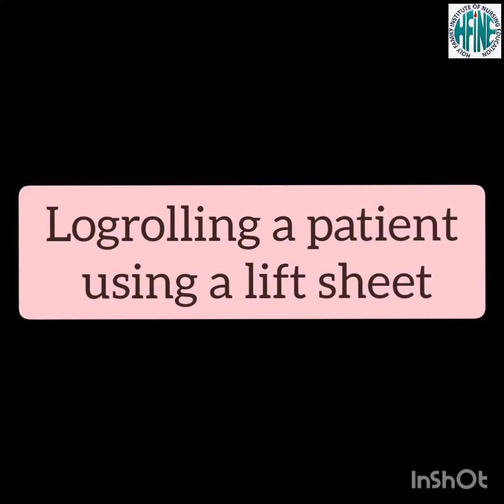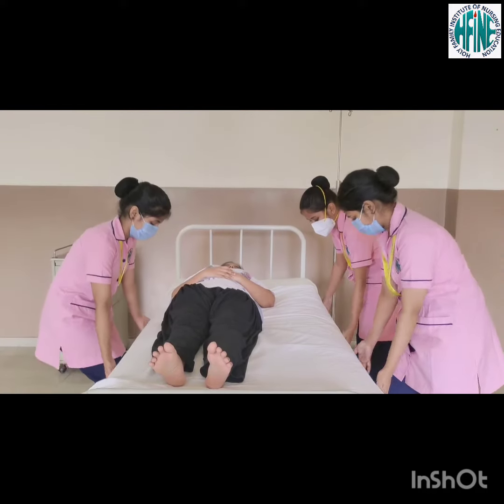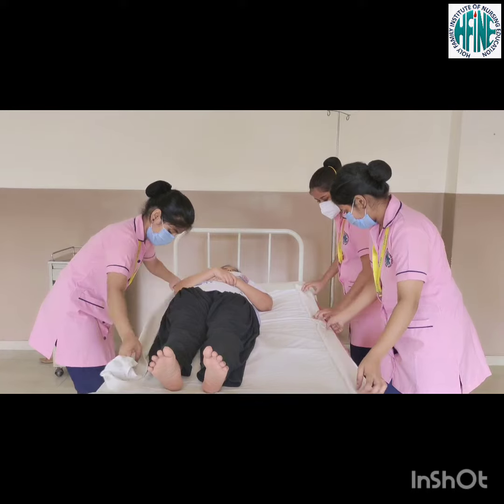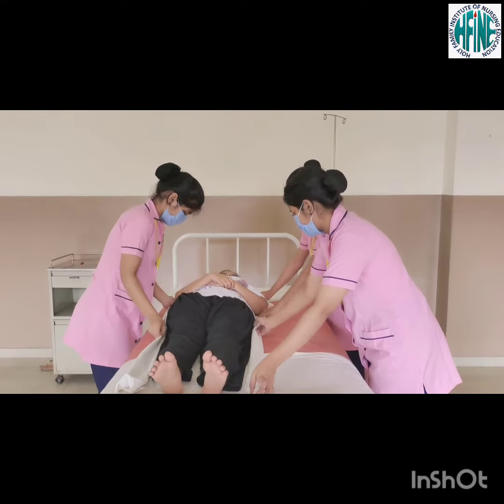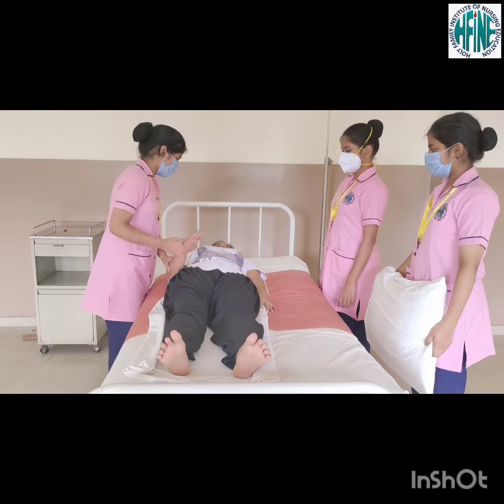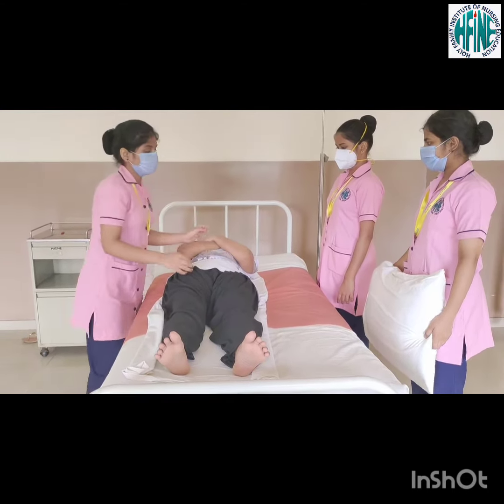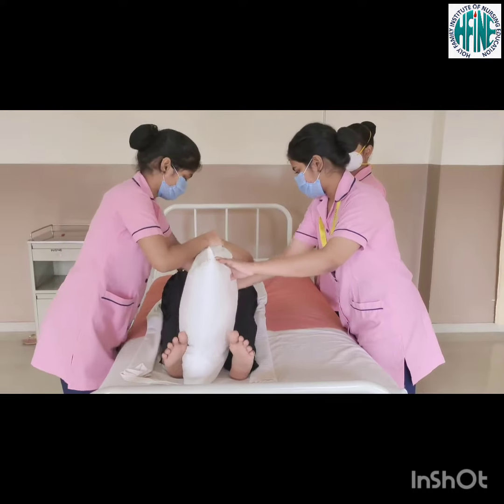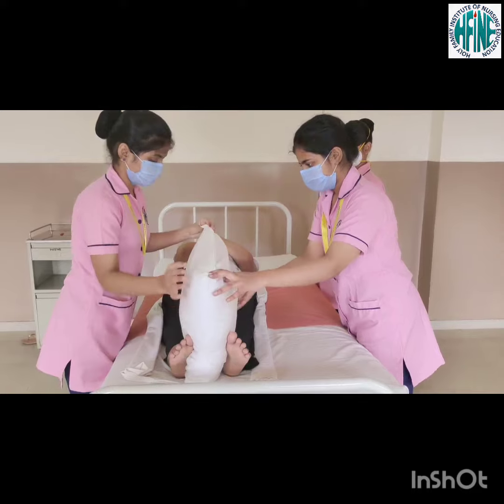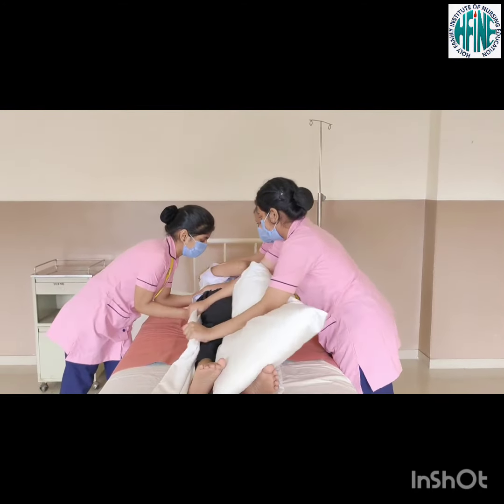Raise side rails next to the patient. Log rolling a patient using a lift sheet. Stand on the same side of the bed. Fan fold the sheet close to the body of the patient. Place the client's arm across the chest. Place one pillow between the client's legs to support the upper leg when the client is turned. On the count of three, all nurses should roll the patient to a lateral position.